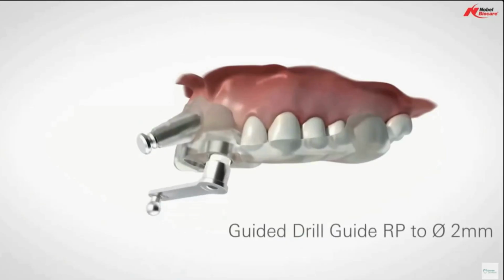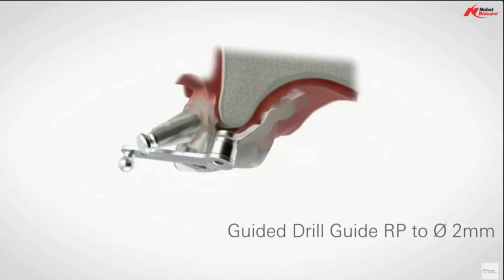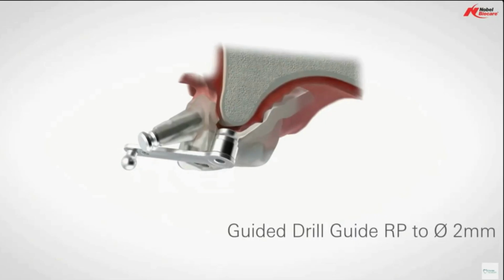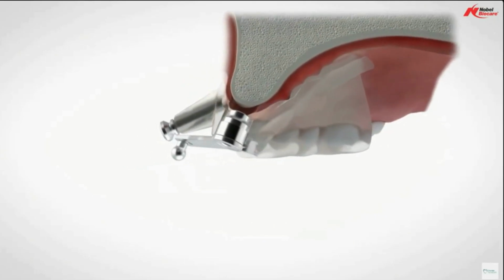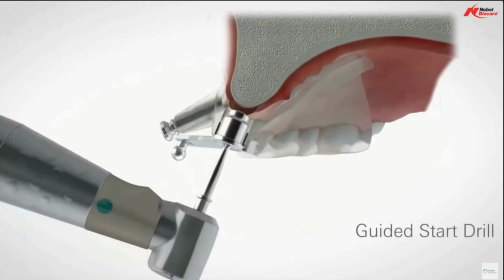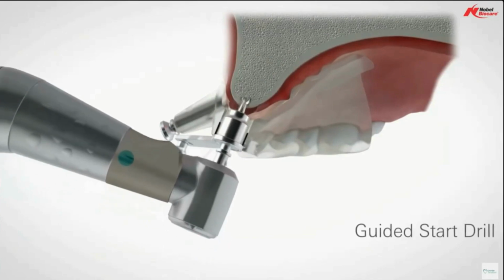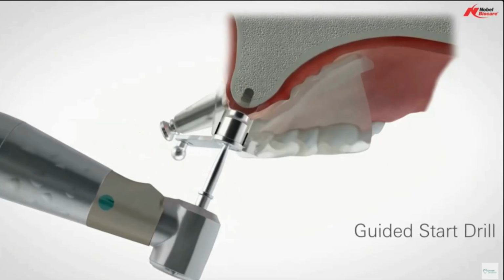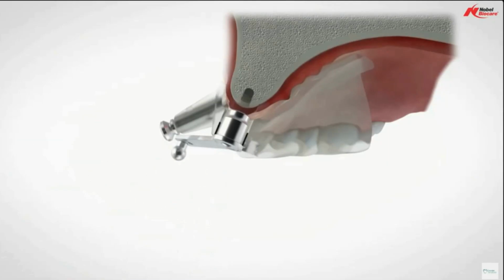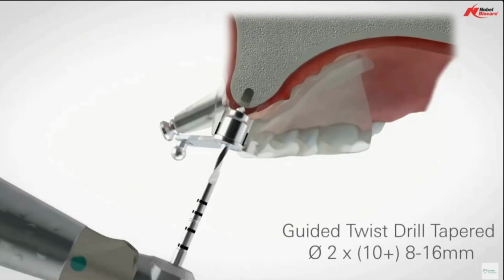Once we have the surgical guide in, this is what I was describing as the drill guide or the spoon, as it were. Some systems have handles or they're longer drill guides, but the whole intent here is that the outer circumference of this drill guide fits into the sleeve, because remember, we're going to place an implant all the way through this, but the inner diameter is stepped up through the varying drills.